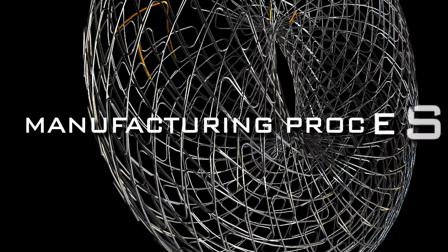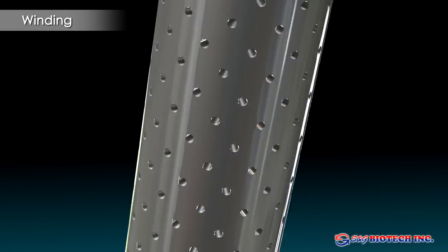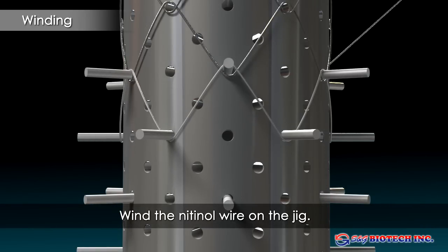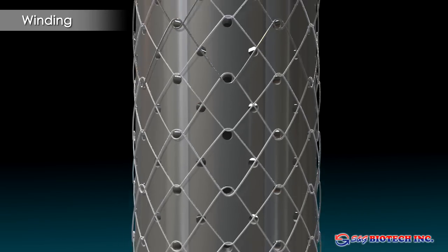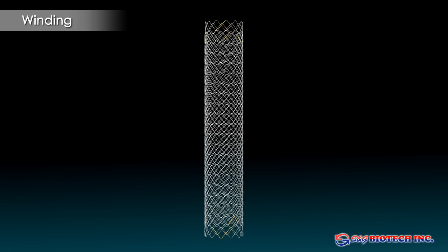Manufacturing process. Stents for different anatomical areas have their own individual design to meet specific requirements. The production process starts with the Nitinol wire being wound around a specific jig to create the stent skeleton. S&G produces the knitted stents, which reduces shortening.